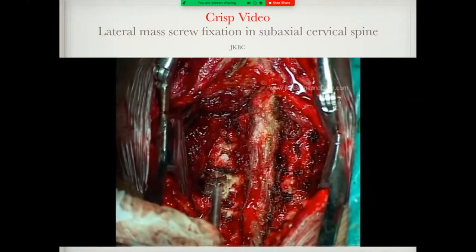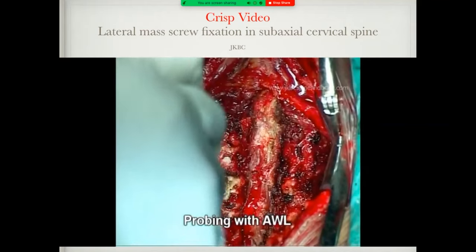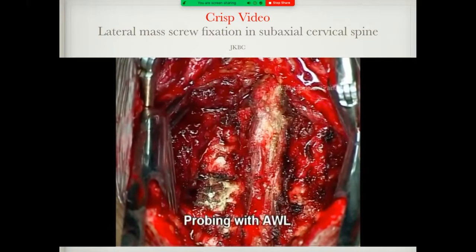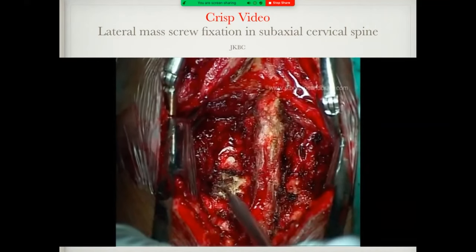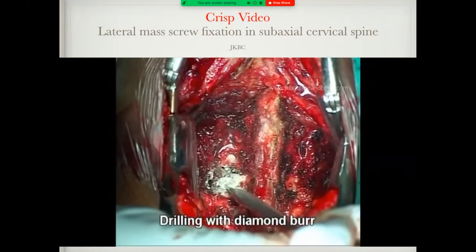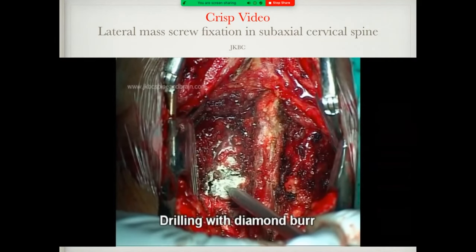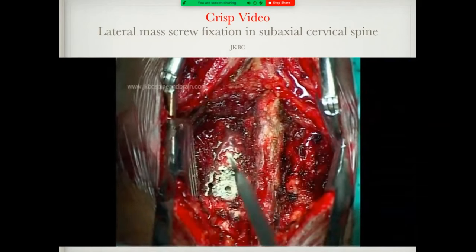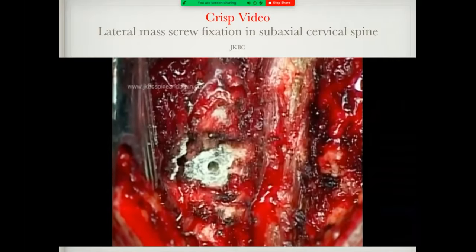You can use one probe to decorticate at the midline, slightly medial to the midline. And then later on use a 2.7 mm diamond drill bit, a long-handled micro drill. Enter into the midpoint and then direct it towards superior and laterally, slowly and gently, until we reach the proximal cortex. Once we reach the proximal cortex, we feel the resistance, and a little bit more drilling can help to breach the proximal cortex. We should not use force.